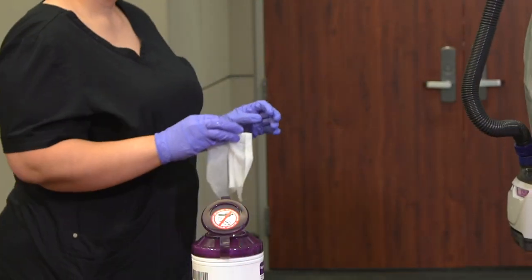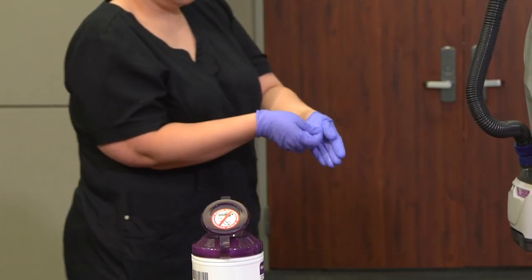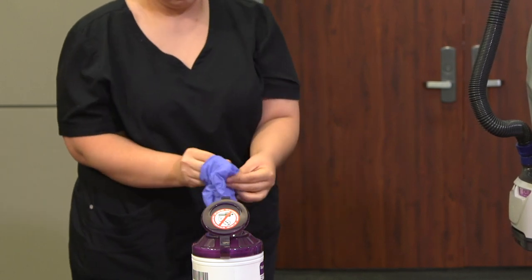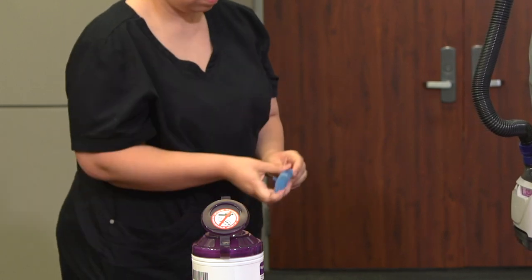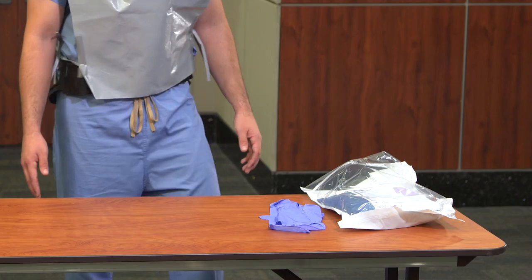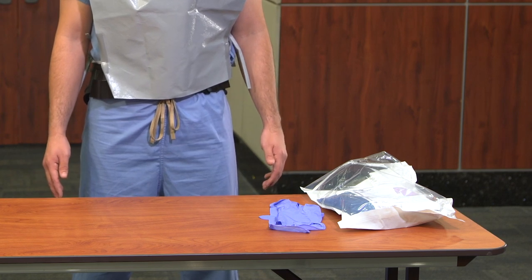The buddy should now doff gloves using glove-to-glove, skin-to-skin technique, and perform hand hygiene. Then obtain all necessary PPE to care for the next patient.